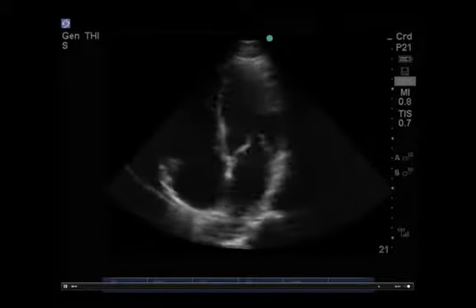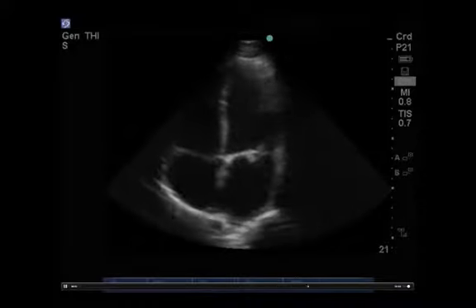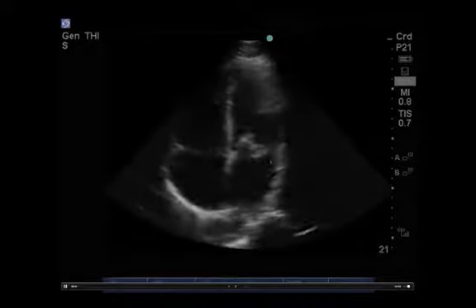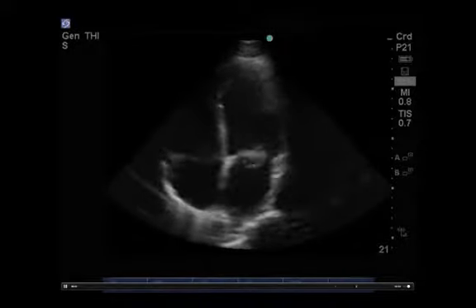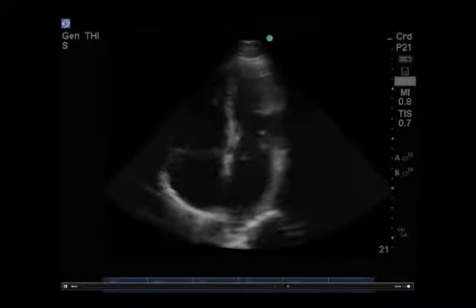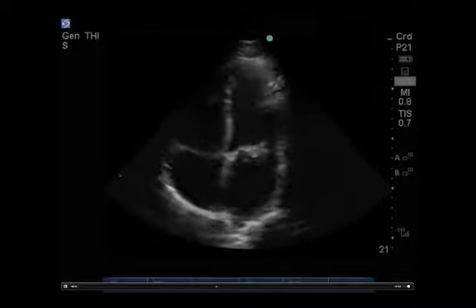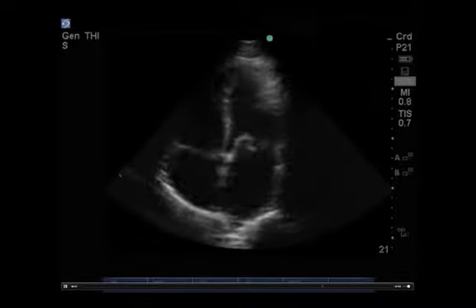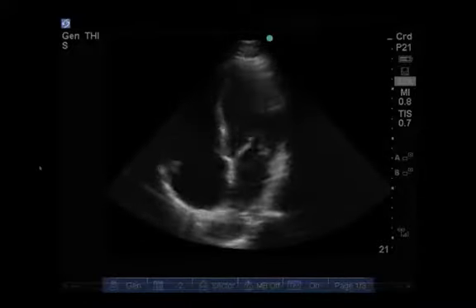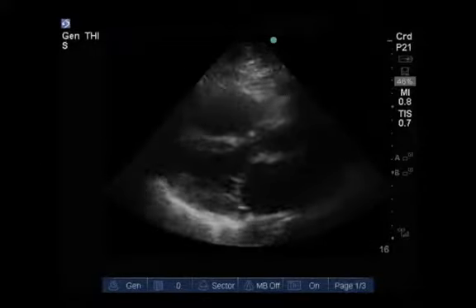We turn our attention to the mitral valve, and we see quite obviously that there is malcoaptation of the anterior and posterior leaflet. In particular, though EKG is lacking from this clip, we can see that the posterior leaflet is coapting behind the anterior leaflet, and this is actually happening throughout the entire phase of systole. So even before applying color or evaluating the severity through Doppler techniques, we can say that this is severe mitral valve failure, as this is diagnostic of a flail mitral valve leaflet.